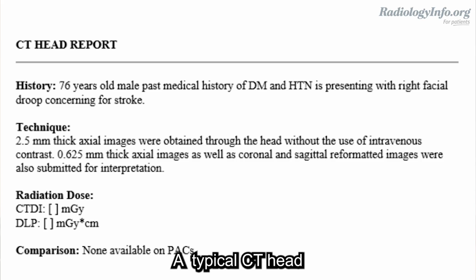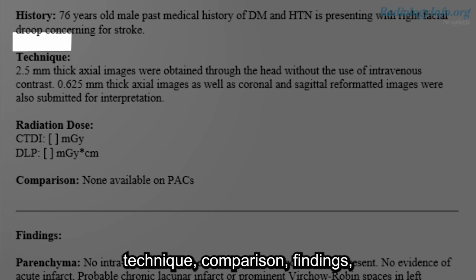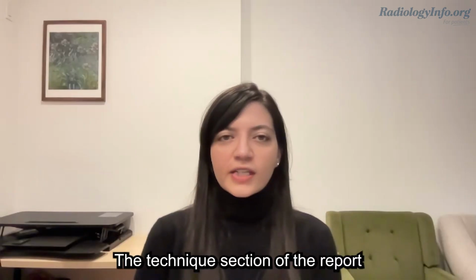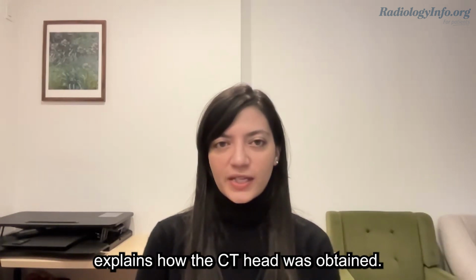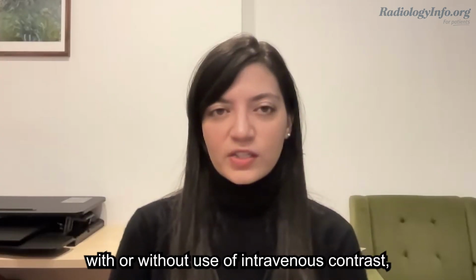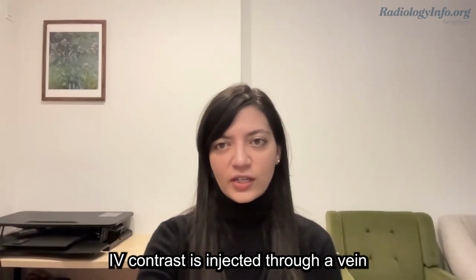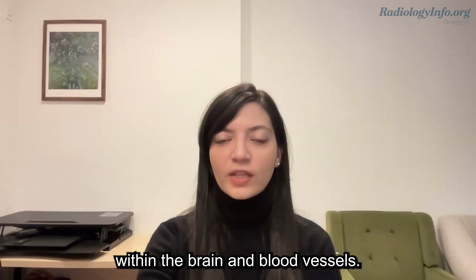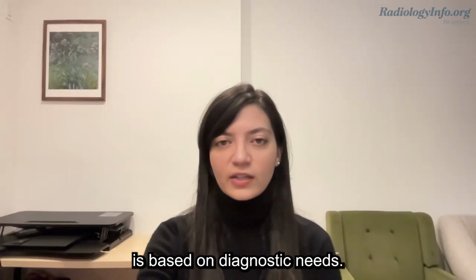A typical CT head report will have a number of different sections, including history, technique, comparison, findings, and impression. The technique section of the report explains how the CT head was obtained. The CT head may be performed with or without use of intravenous contrast, depending on clinical indication. IV contrast is injected through a vein and helps visualize certain structures and abnormalities within the brain and blood vessels. The decision to use contrast is based on diagnostic needs.